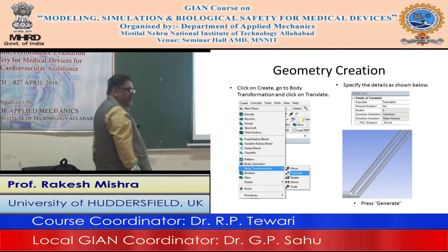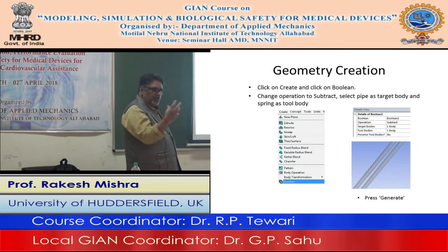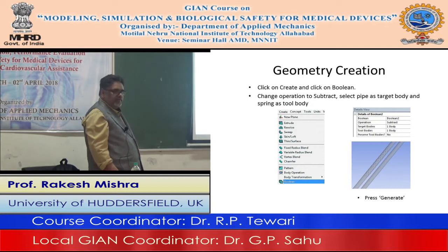And now what we do is, because the stent is a solid body, okay, and we have to model the flow around the body. In CFD, you can do it by subtracting the solid body from the flow domain. So what we have done here is, we are carrying out subtraction of this solid body from the flow domain, so that the flow can take place around the body inside the artery. So we go for Boolean operation and we subtract. This stent is the tool body, the outer one is the target body, and we subtract the stent from one of the arteries. So now we have, and then we press generate.